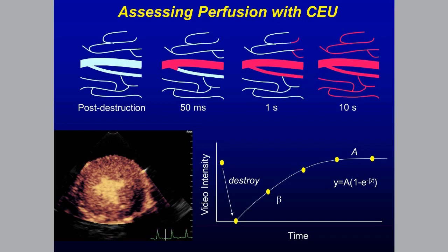Yeah. For agitated saline, basically if I'm going to use that to get my TR jet, it does enhance the signal, and you have to be really careful because it can have a little bit of blooming and bleeding of that signal. So you'd really want to take that dark modal velocity, not those little outliers that come off the fringe. I would also do it at the very end, when most of your saline has already left and you have very little bubble effect. And I think it can be helpful on those really challenging TR jets.